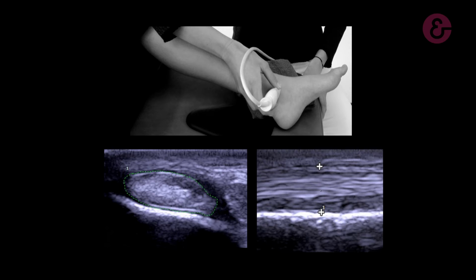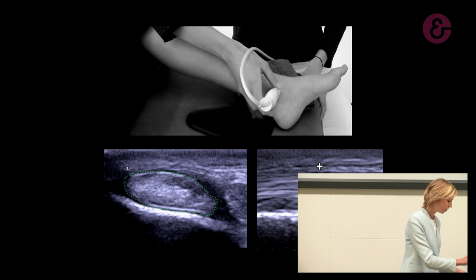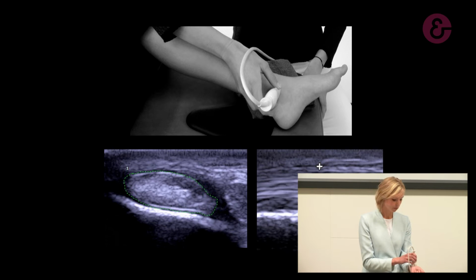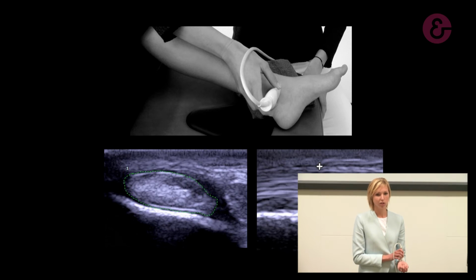To give you a better insight into how ultrasound works, I will use my own wrist and carpal tunnel as an example. The transducer must be placed at a 90-degree angle to the structures, which we call perpendicular, at all times. When the transducer is placed perpendicular to the orientation of the tendon fibres, they will appear bright and reflective.